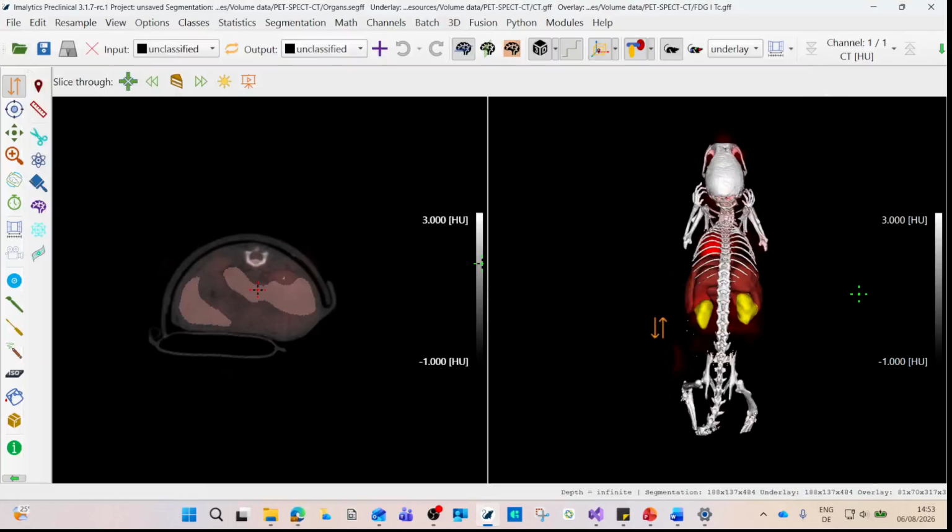And in this video, I walk you through some of the new key features. For a complete list of all improvements and bug fixes, please visit our website at imalytics.com, because I don't have the time to show all new features here, but we also covered several of the new features in our recent LinkedIn post. So just check out our Imalytics LinkedIn page, and you can also find some additional information and informative videos there. Let's start with the new features.